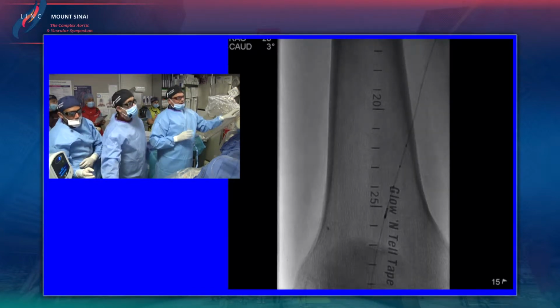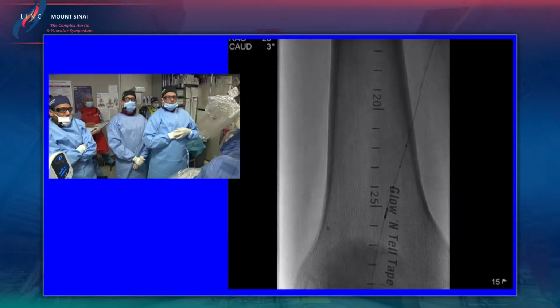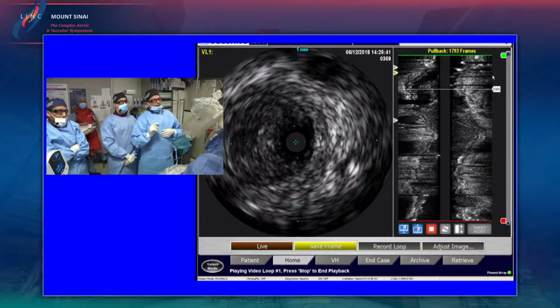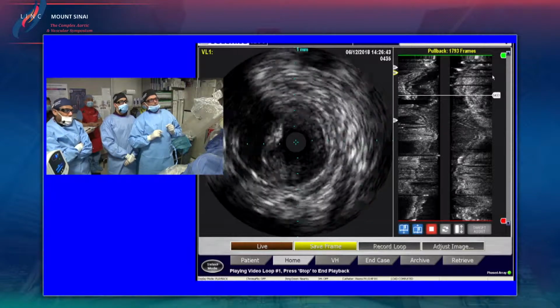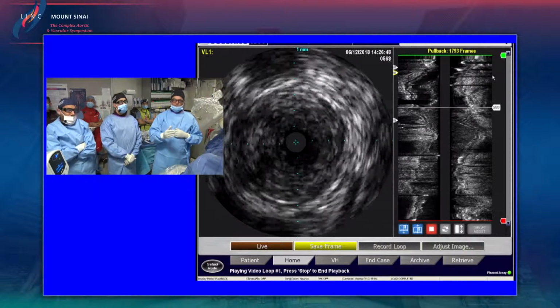And then we did an intravascular ultrasound. So play the IVUS, guys, because it's very important for them. The wire was going very, very smoothly, and you could see here you have a lot of speckled thrombus. There was not an issue with the Viance. We weren't meeting any resistance when we were going down.